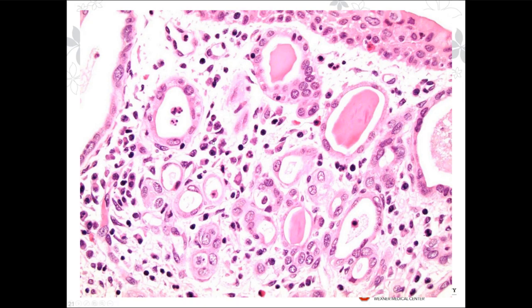So this is an example of a nephrogenic metaplasia or nephrogenic adenoma. You have these tubules. They look pretty atypical. If you look at this nucleus, they are very, very atypical looking. And I've seen these being called adenocarcinomas. But the key thing is look at the inflammation in the background. Look at all the plasma cells, look at all the lymphocytes. And most often, these patients have a history of repeated instrumentation.